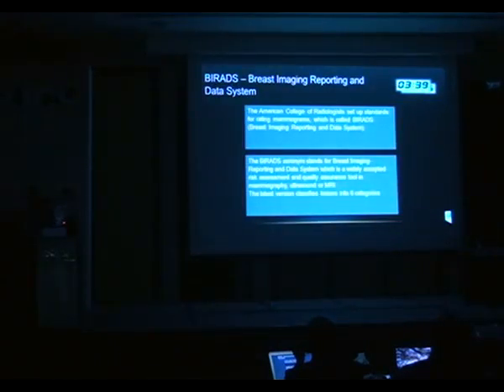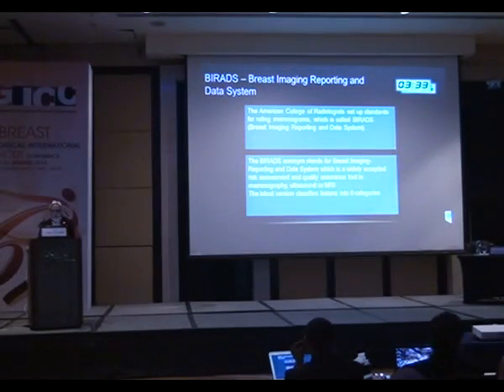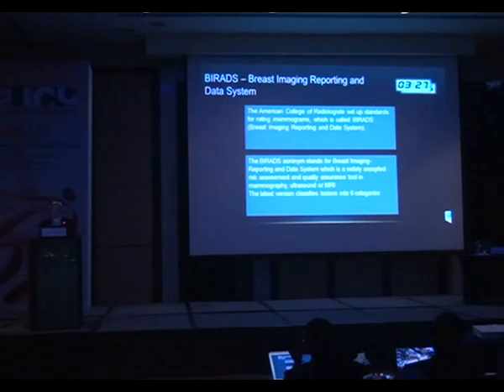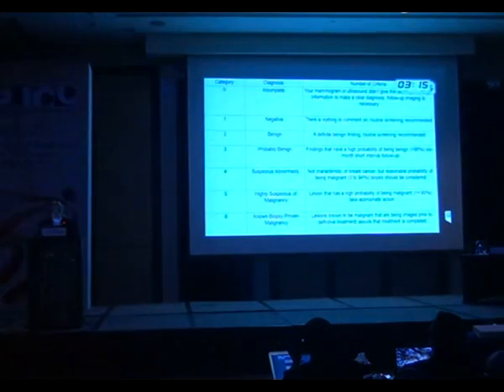The BI-RADS, finally. The BI-RADS, set by the American College of Radiologists as the standard for rating mammograms, stands for Breast Imaging Reporting and Data System, which is a widely accepted risk assessment and quality assurance tool for mammography, ultrasound, and MRI. The latest classifies the BI-RADS into category 0 and then followed by 6 other categories.